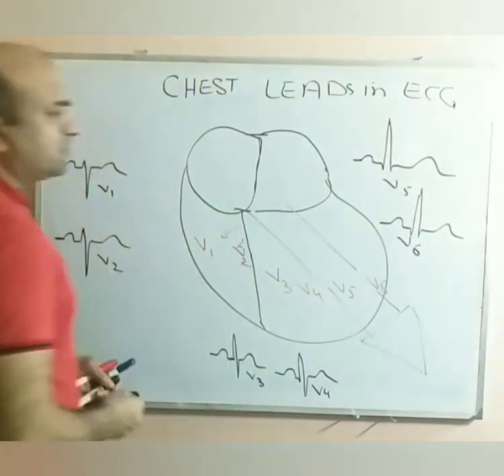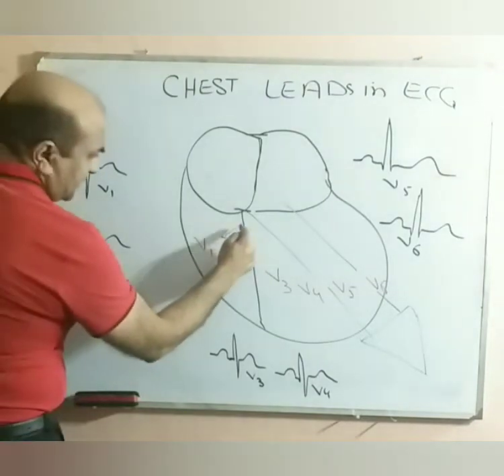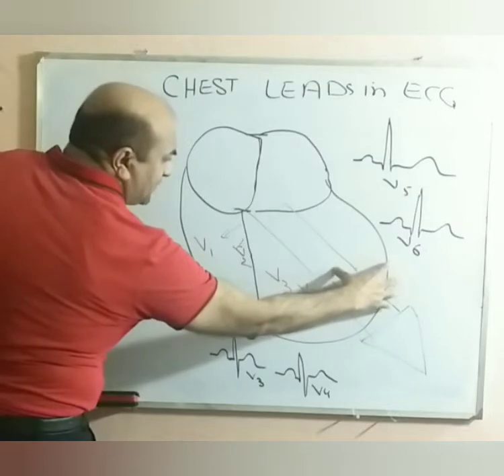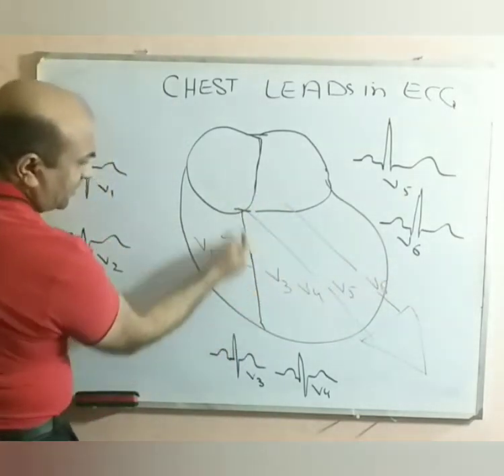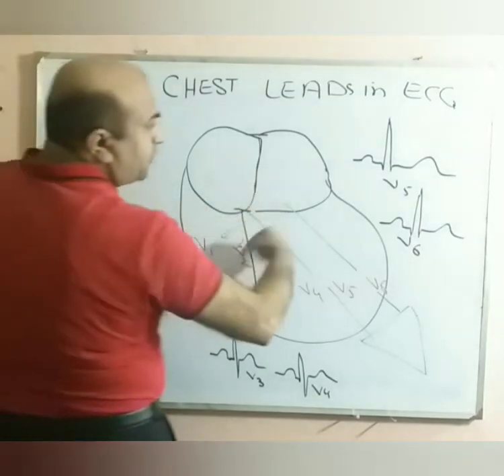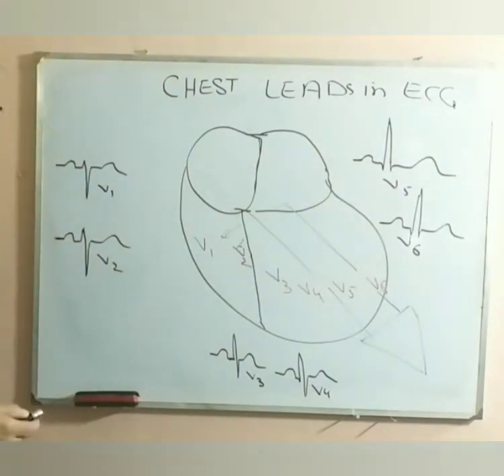Why do they have a small Q wave, which we call the physiological Q wave, this initial downward deflection? Because this septal depolarization is going away from V5 and V6, so they see this smaller electrical activity, or flow of current, going away from them, so they generate a first downward, negative deflection, which we call the physiological Q wave.